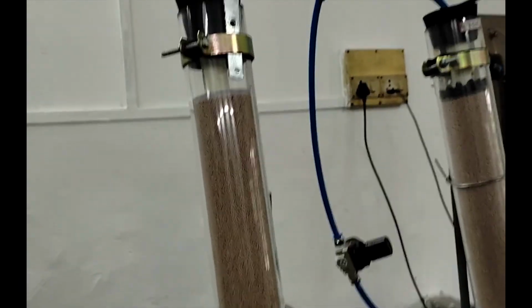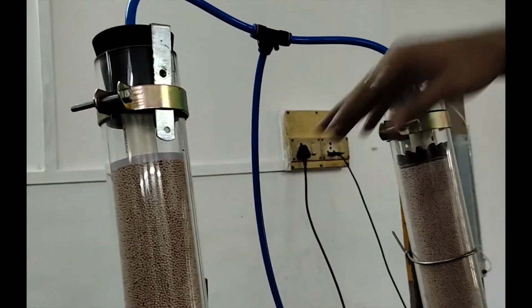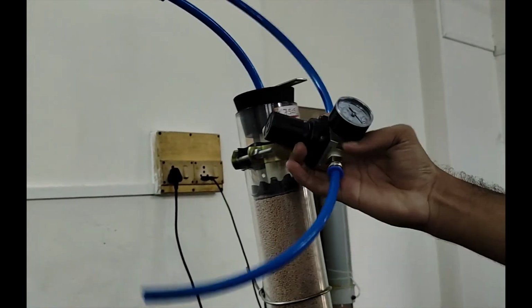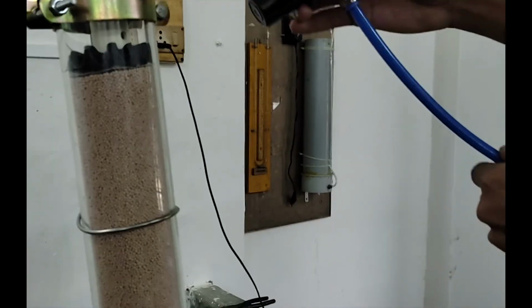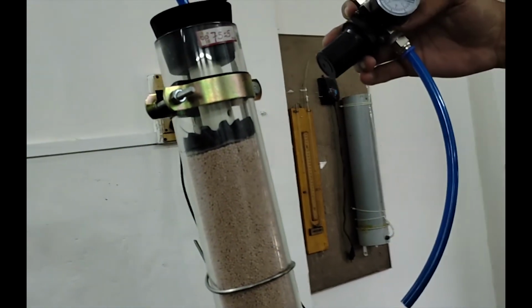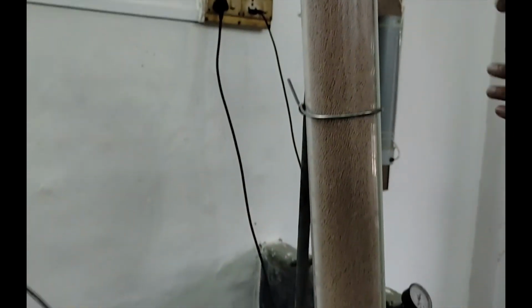At the end of both of the columns we get the oxygen air supply, which we can regulate through this regulator. Here you can see the regulator, and after that you can also store that in an oxygen tank or maybe a container where you want to store the oxygen, and then use it for other purposes.